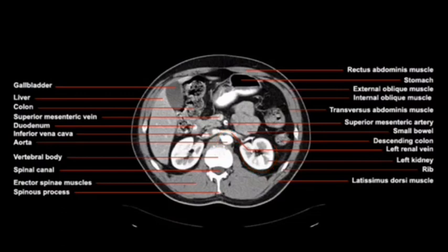At this stage, we can actually also see the renal veins from the right as well as the left extending over to the inferior vena cava. We can still see a small portion of the contrast-filled stomach. Don't be confused. Notice that this bright part on the posterior side of the patient is simply the contrast in the stomach. The patient is laying on their back, and so we can see air in the anterior side of the stomach. We can still see those kidneys.